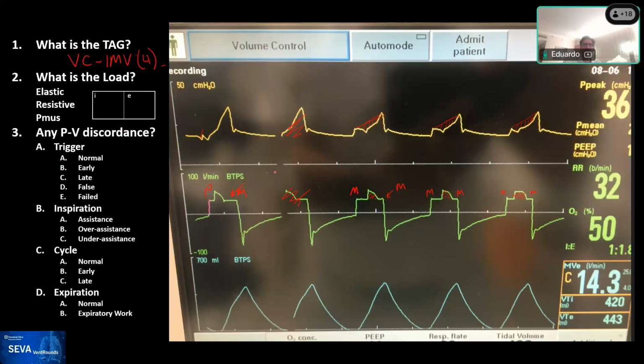So in reality, doing this type of analysis, to put the name of a mode and what it actually does, takes reading the manual and doing a very detailed analysis to ensure that we are naming things right. In general terms, the message is that what you see on the screen may not reveal the full extent of what the ventilator does. And that's why using the Rosetta Stone or the ventilator mode map can give you the answer.